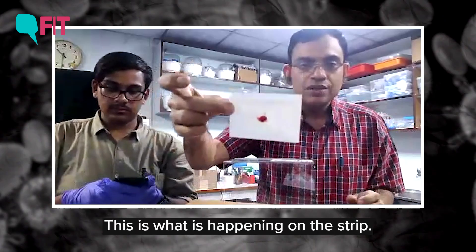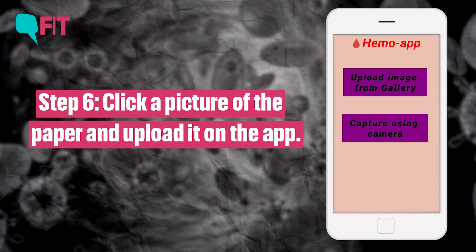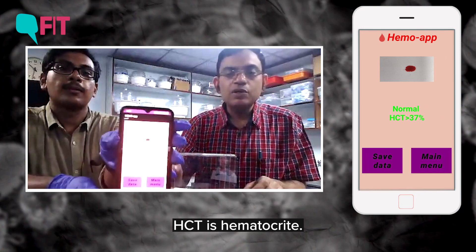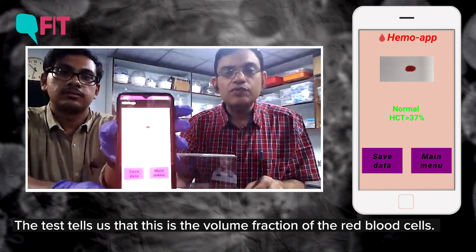This strip I will show you. This is what is happening in the strip. It tells that this HCT is hematocrit — that means it also tells us this is the volume fraction of red blood cell.